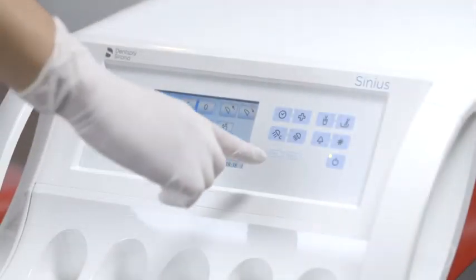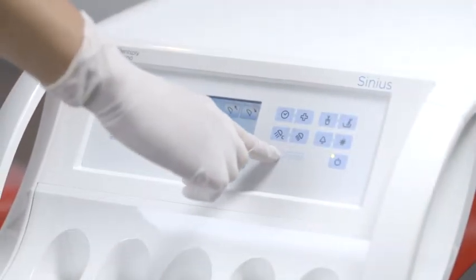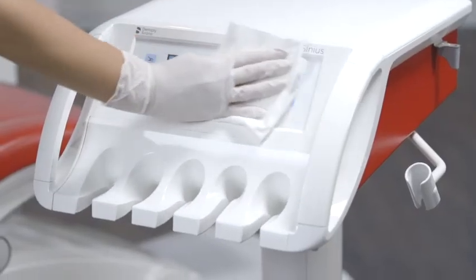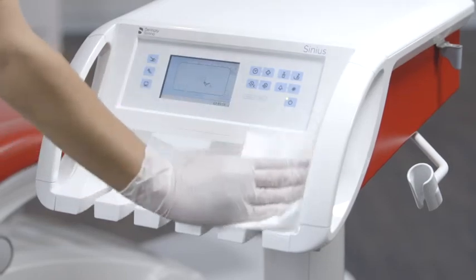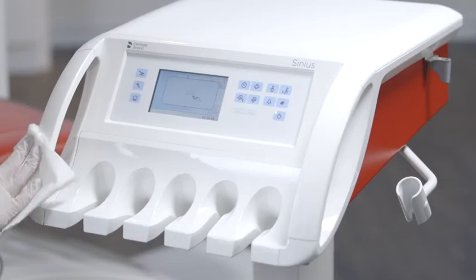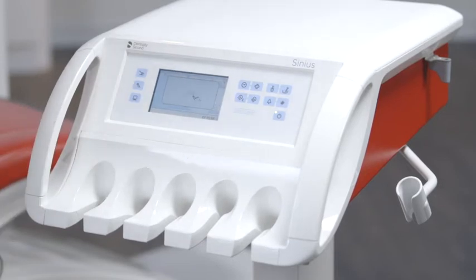First, lock the user interface by pressing the clean button on the dentist element. Now clean the silicone pad, the graphical user interface, the instrument holder, the handles of the dentist element, and infection prevention critical surfaces.